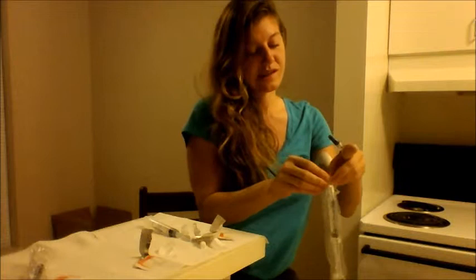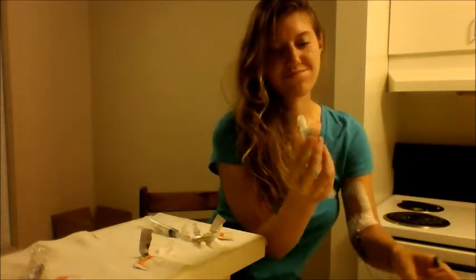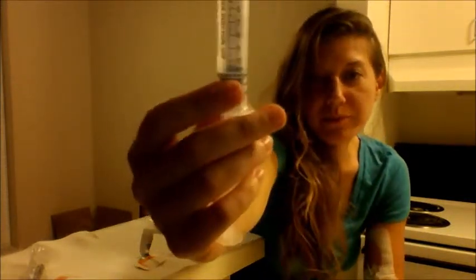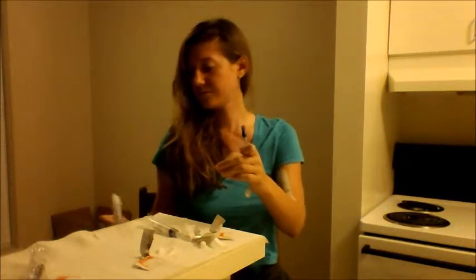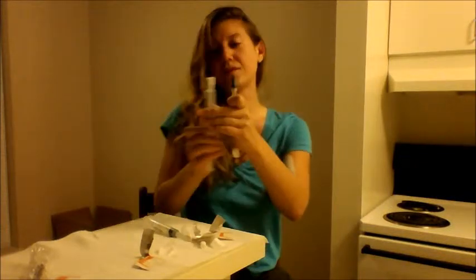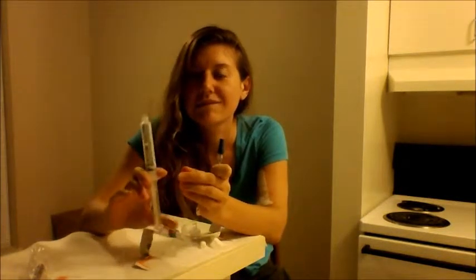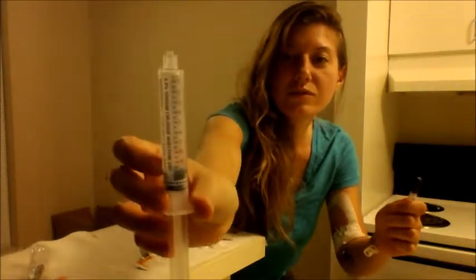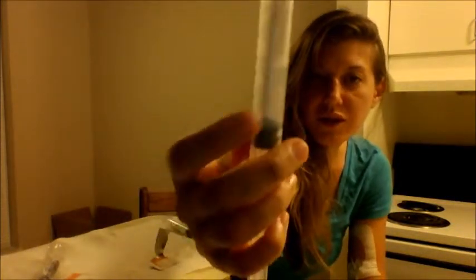There are air bubbles at the bottom — I'm going to bang them out. Squeeze it until it comes out the top a little bit. It's totally normal. So I have it all the way to the top, it's ready to go. There's no air in here — no air bubbles.